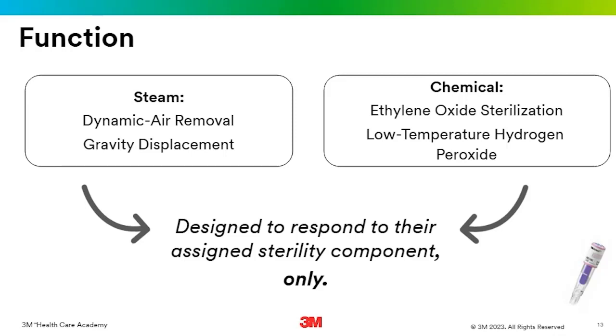And how many of us haven't really dried a product off, put it in the chemical sterilizer, and now it's failed, right? So hopefully you're not doing that with your ethylene oxide. That's a little bit more serious than a very obnoxious noise. But the point I'm trying to get across is that while we utilize steam and chemicals, they have their own set of indicators that are designed to work accordingly in that space.